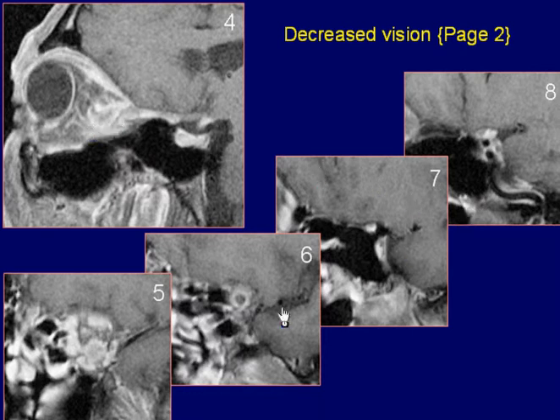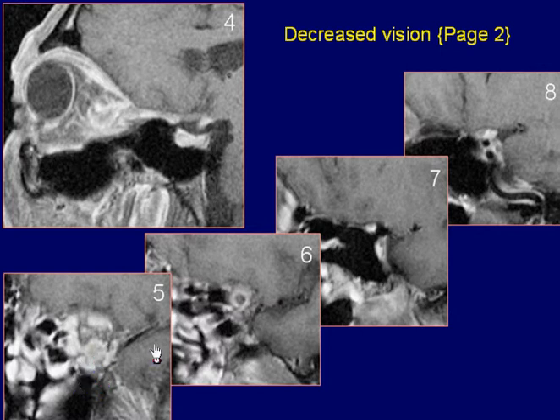Oblique coronal post-contrast fat saturation images from the orbit to the optic chiasm demonstrate again peripheral enhancement of the left optic nerve lesion with posterior extension through the optic foramen to the chiasm.